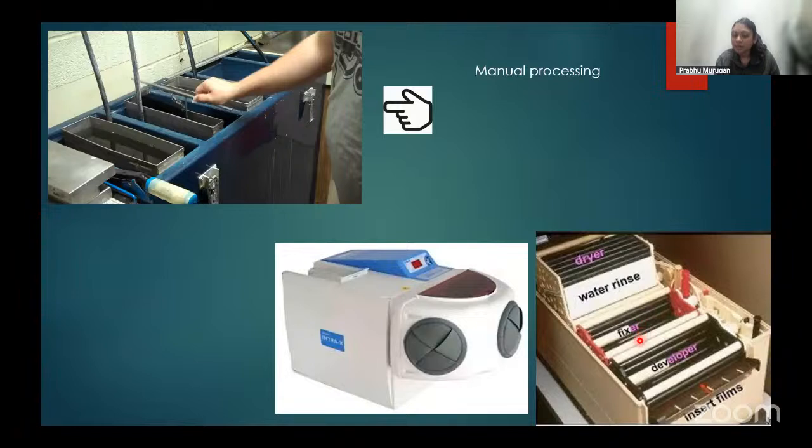So this X-ray film will move over this roller, go inside, and get dipped in the developer. Then again it'll move over and get dipped inside the fixer. Then it'll be rinsed with water. There'll be a drying rack also, after which you'll get the X-ray film on the opposite side. This is your automatic processing unit.